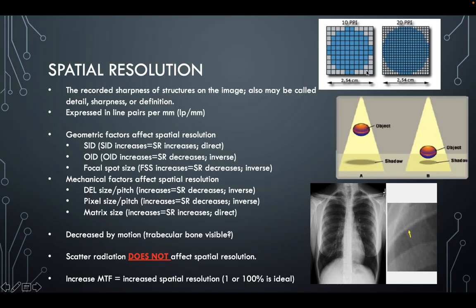So this is a 10 by 10 matrix, which gives me 100 pixels here. And now I have 1, 2, 3, 4, 5, 6. I'm going to assume it's 20, so you guys don't have to hear me count. So 20 by 20. So now I have 400 pixels in here. So huge difference in the matrix size. So I've gone from 100 to 400, even though my field of view hasn't changed.